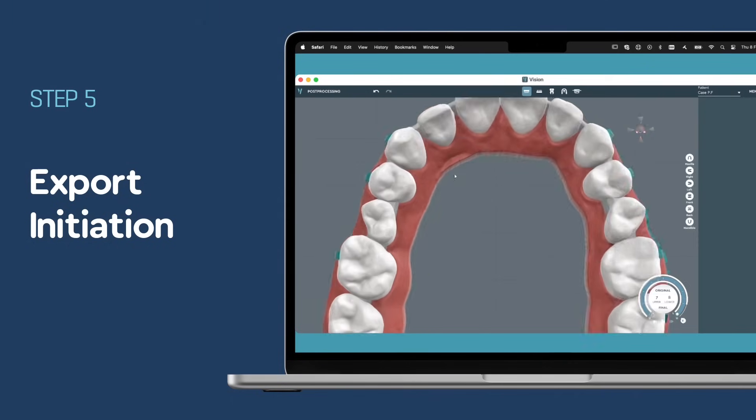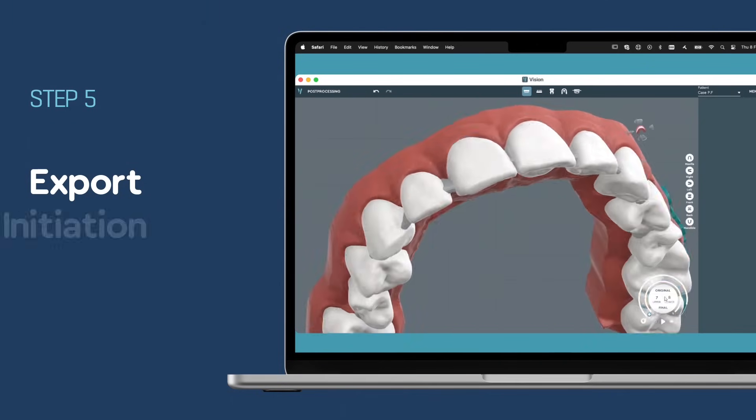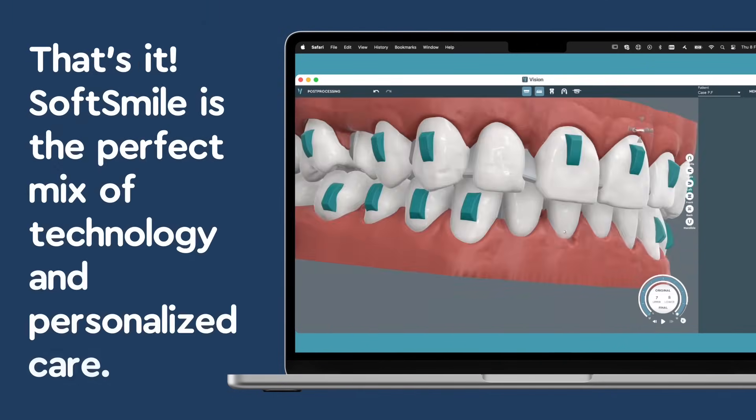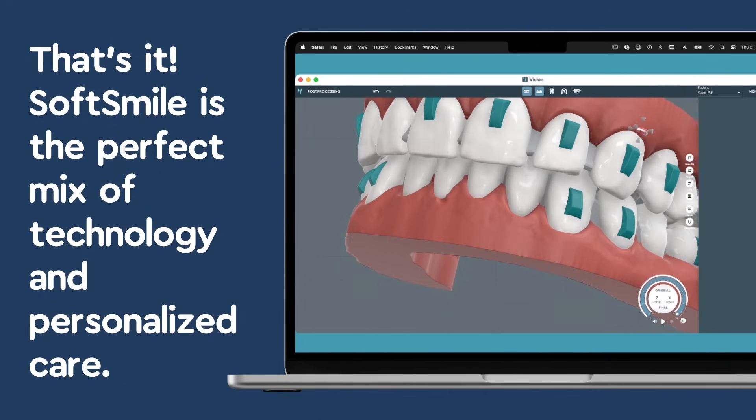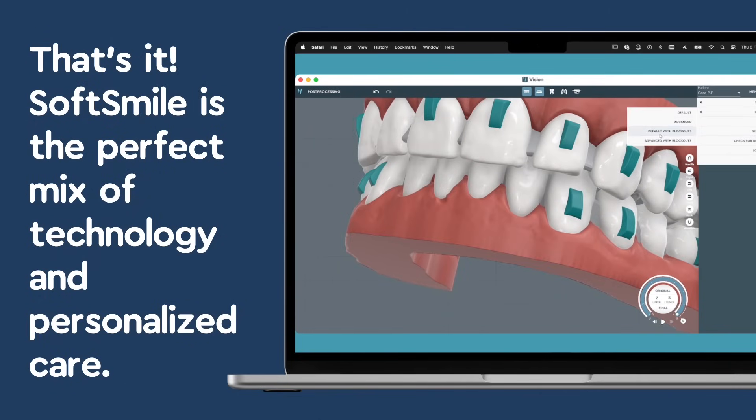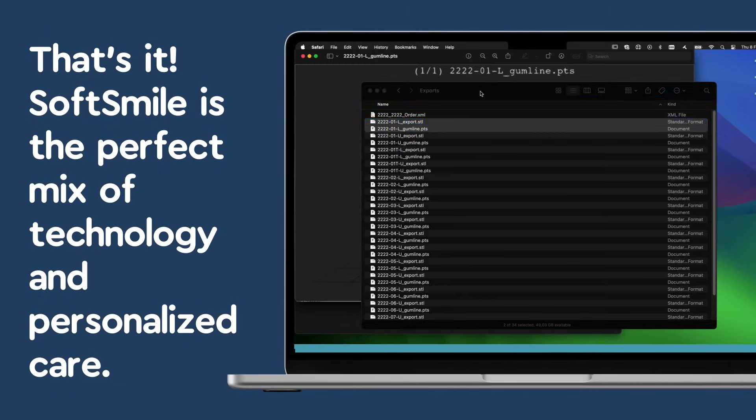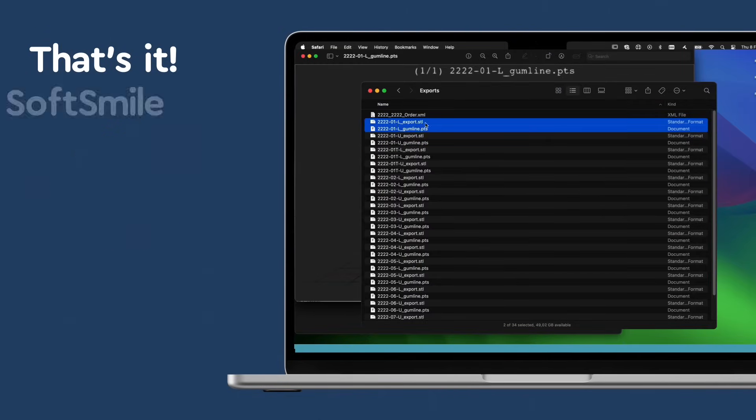After the treatment plan has been approved, we move forward with the crucial step of exporting your patient's custom aligners. Click Export to download the export files.